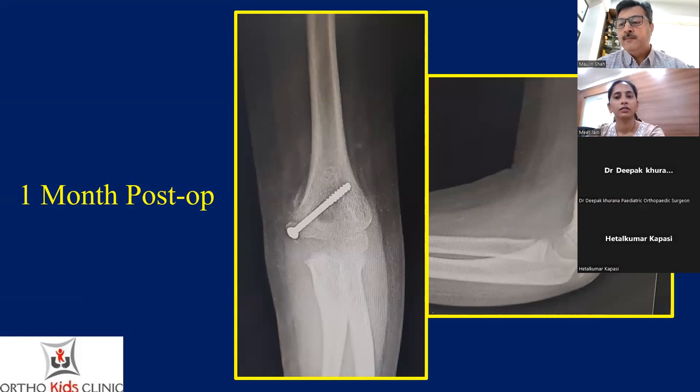So right. What is your cutoff regarding the displacement? Because actual displacement, which we can see on X-ray, is much more on CT. Yeah. So what we see on X-ray is not a neutral view. So it's a rotated view. The medial epicondyle lies a little posterior. So people have recommended that you do a CT scan. But on X-ray, this was looking displaced and it was flipped and reversed.